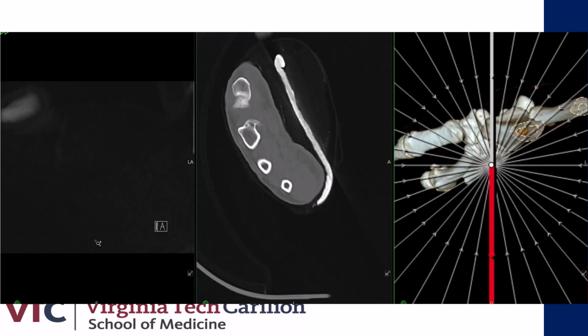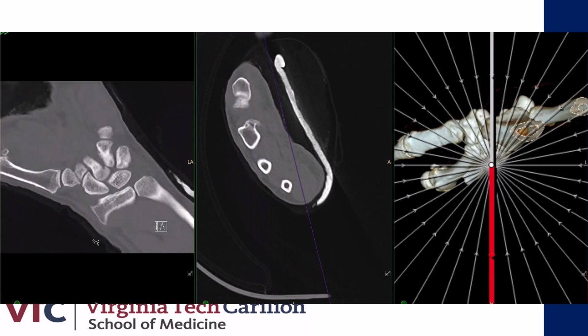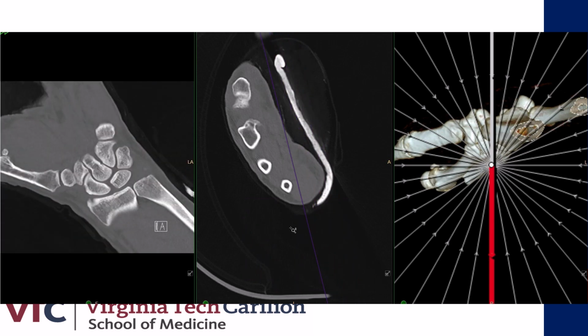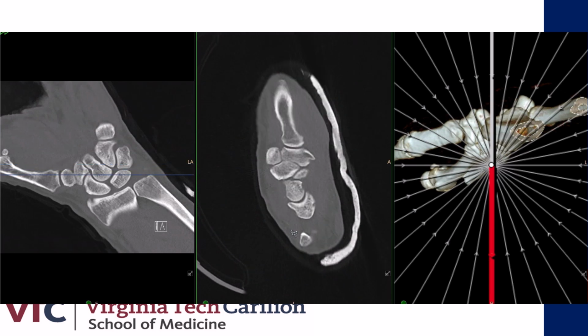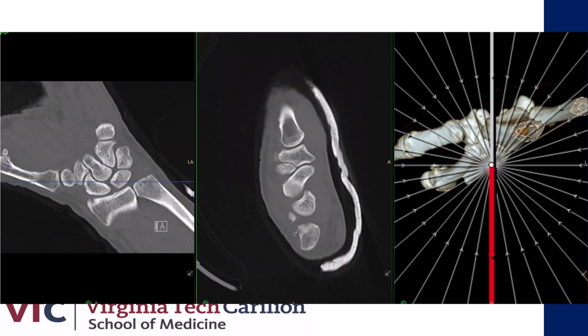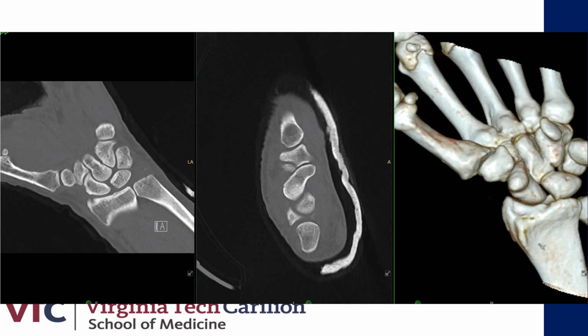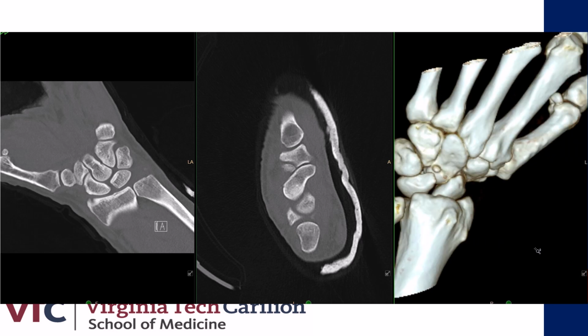A post-reduction CT scan was obtained to look for any occult fractures or any other injuries, and you can see here in the coronals there are no injuries to speak of. Here the sagittals along the scaphoid axis didn't demonstrate any occult fractures to the scaphoid or anything else. And then you can see here over on the right a 3D reconstruction showing the successful lunate reduction.